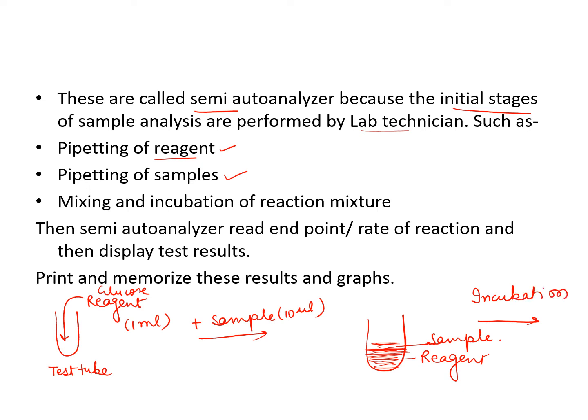Like if there is an incubation of 10 minutes, for example, we will incubate it for 10 minutes. Then mixing and incubation of the reaction mixture is done by the LT. Okay, the LT will keep this mixture in the incubator or at room temperature for 10 minutes. Okay, then there will be color development. Now, all these functions are done by the LT or lab technician: reagent pipetting, then sample pipetting, then mixing of reagent and sample, and then incubation of this reaction mixture.